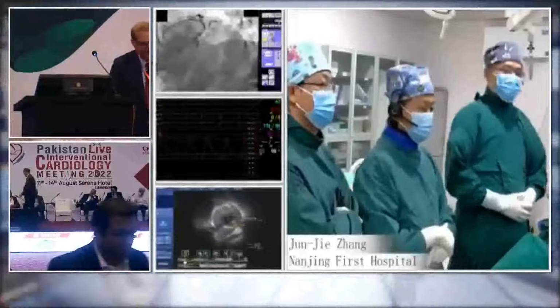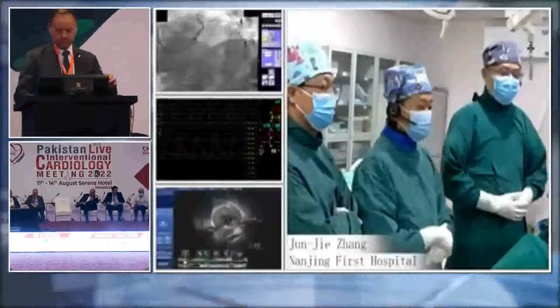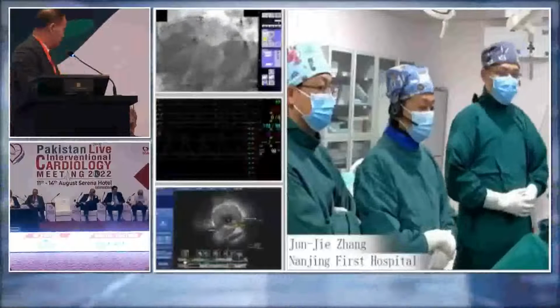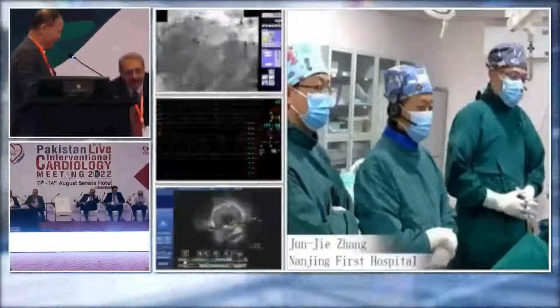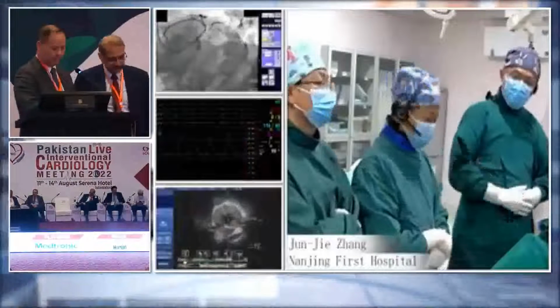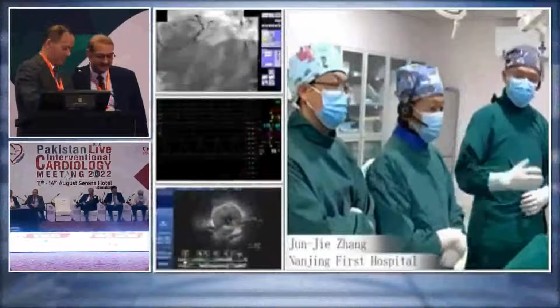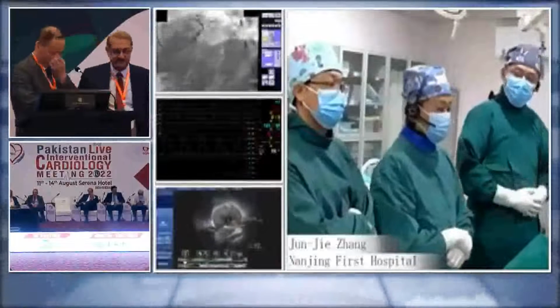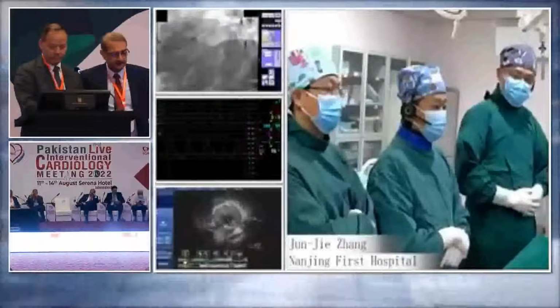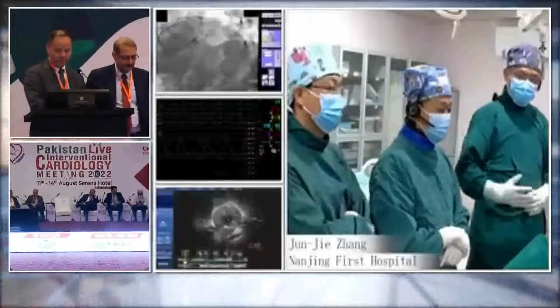Sure. I'm Dr. Junjie Zhang from Nanjing First Hospital. On behalf of Professor Shaoliang Chen, I really appreciate your kind invitation to participate in Pakistan Live 2022. So, Dr. Raza, first, let me introduce my team. On my right hand, Dr. Ge Zhen and Dr. Li Xiaobo will assist me in performing the case. And also our technician in chief, Ms. Pan Tao, will interpret the IVUS. So first, let Dr. Ge Zhen introduce the case information. Please, Dr. Ge Zhen.